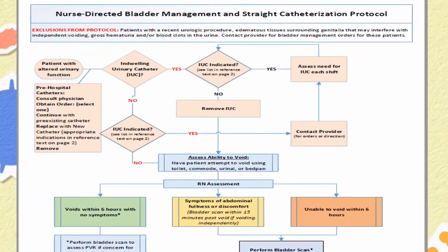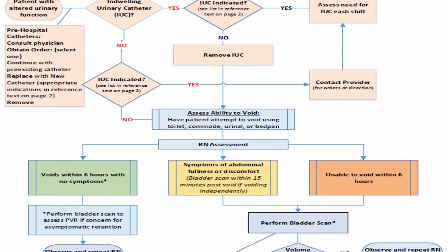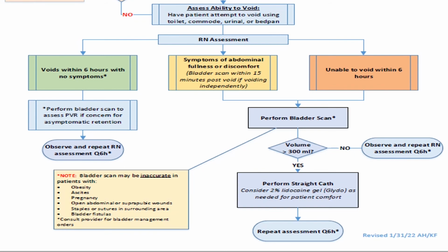For our reference, this is our nurse-directed bladder management and straight catheterization protocol.